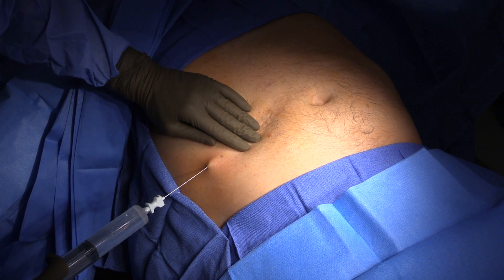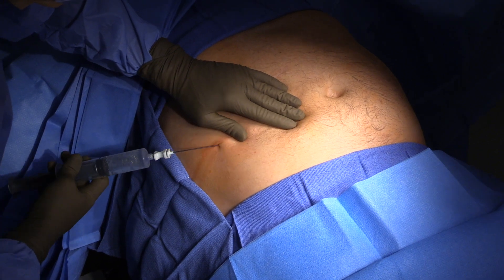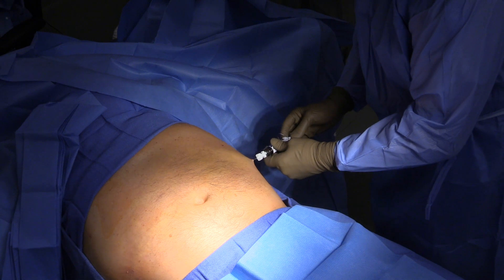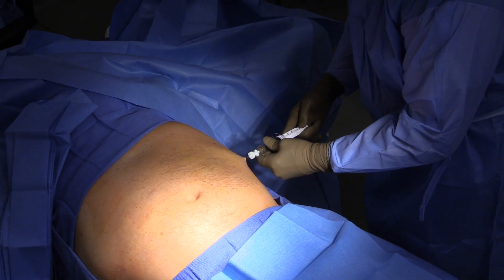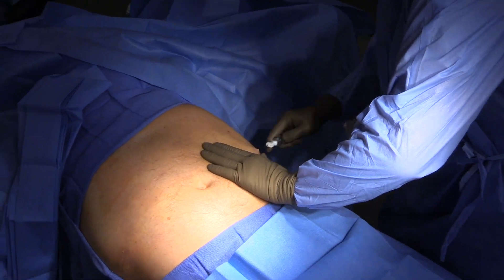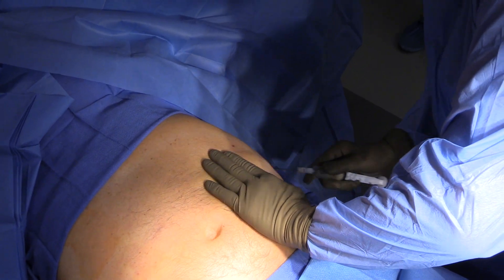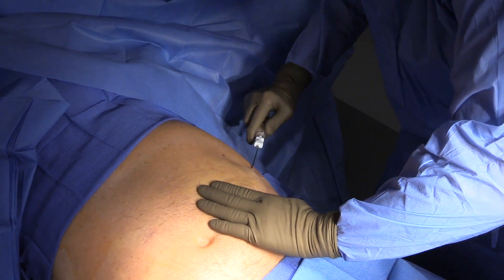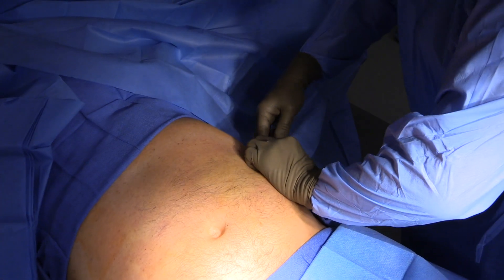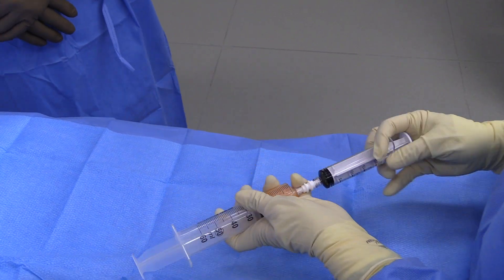60 mLs of solution are injected above and below the umbilicus and a gentle agitation technique is applied to the belly while emulsification takes place. Liposuction of the abdominal fat is performed using brisk, broad strokes, with a total of 80 to 120 mLs of aspirate obtained depending on the patient's body habitus. We go above and below the umbilicus using this agitation technique while having the luer-lock pulled back so that pressure brings the fat into the syringe. The fat is then transferred for processing.